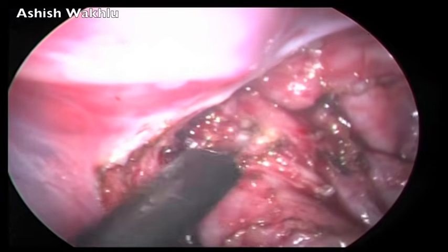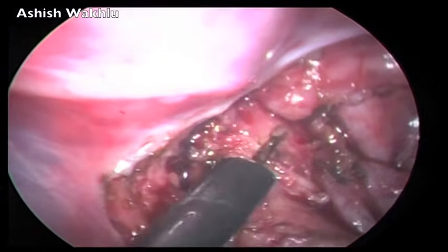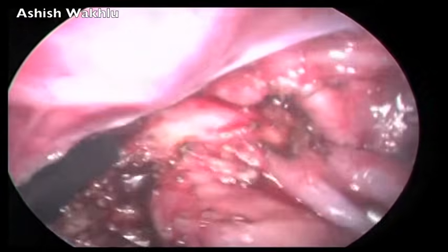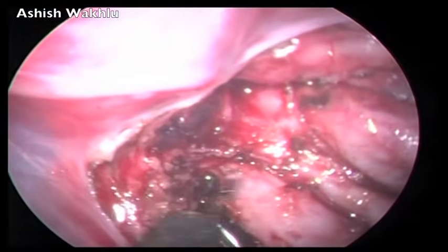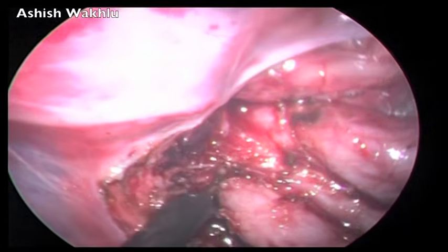We are continuing to progressively narrow down the fistula, dissecting from the anterior, the right, and the left sides, and now approaching the prostatic urethra.